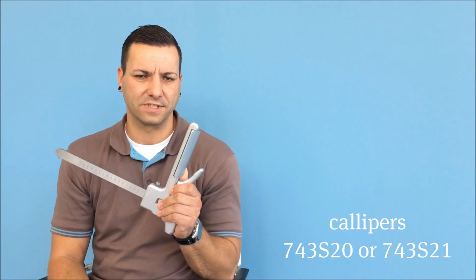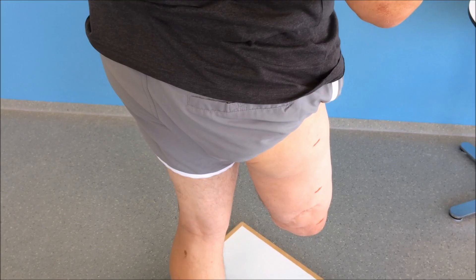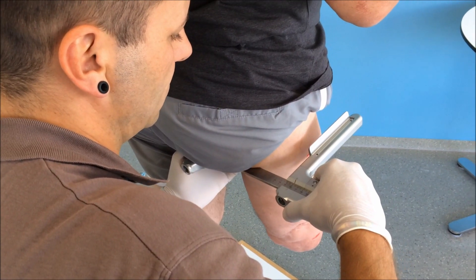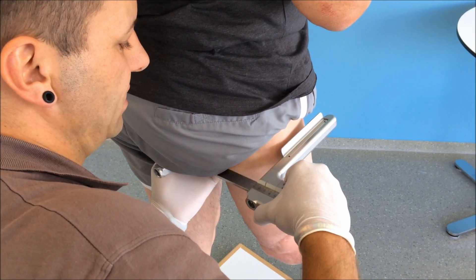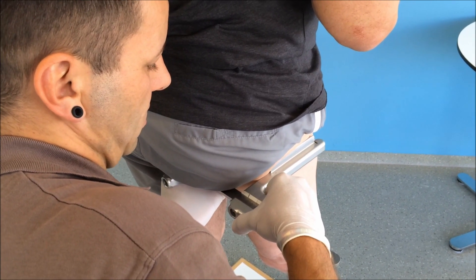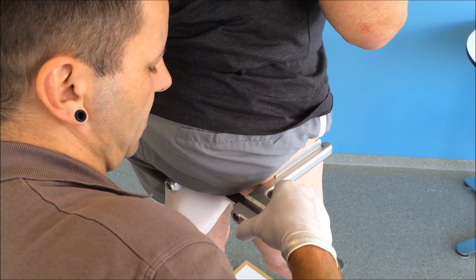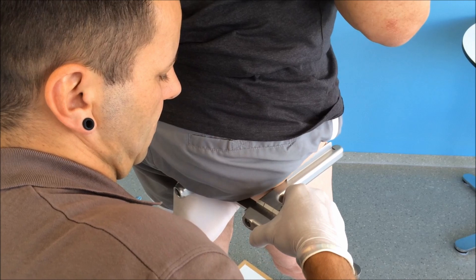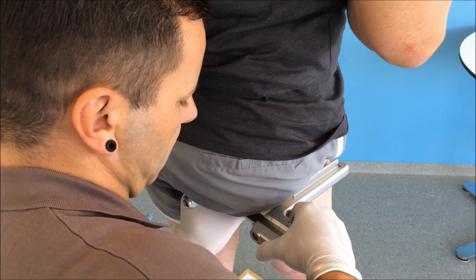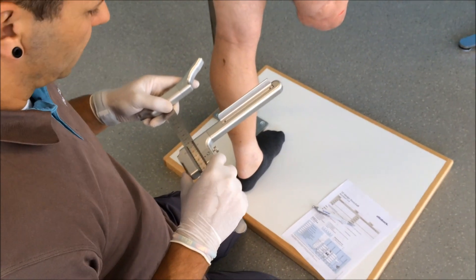To find the bony ML measurement we use the 743 S20 calipers and the corresponding angle support for women or men. To find the ML dimension we slide the calipers below the ramus, enclose it and lock it at an angle of 90 degrees. We then move the calipers in the lateral direction and when the movement is transferred to the user at a ratio of 1 to 1, we know we've got the right spot. Read off the measurement and fill it in on the order form.